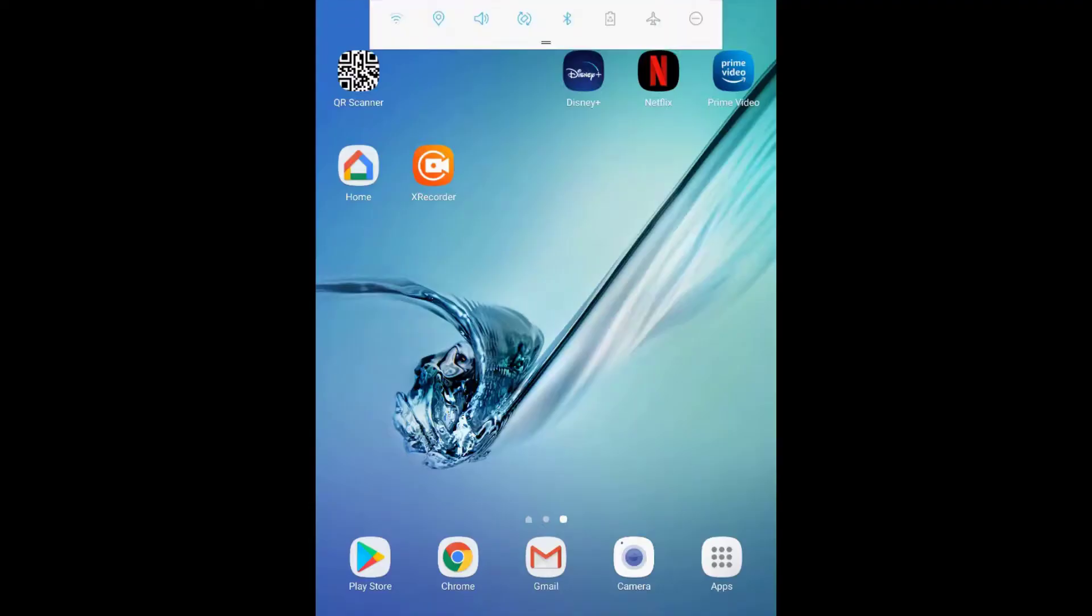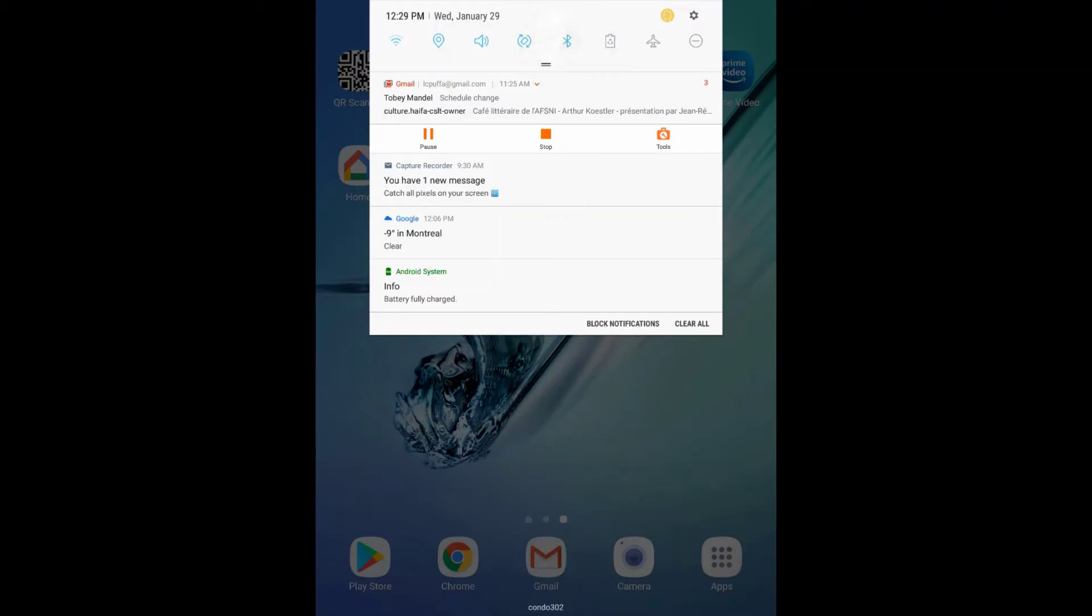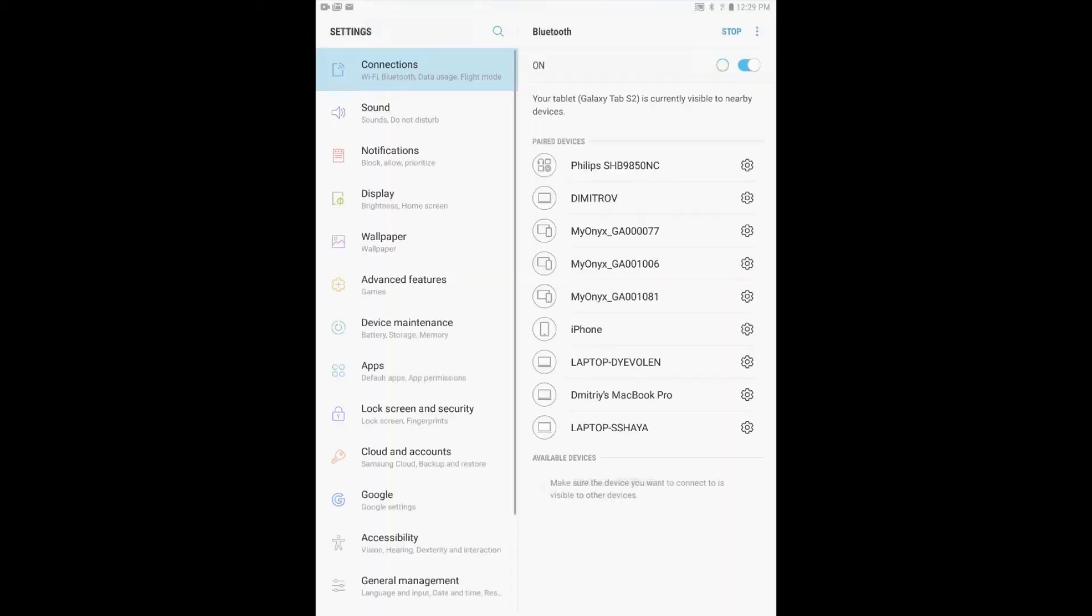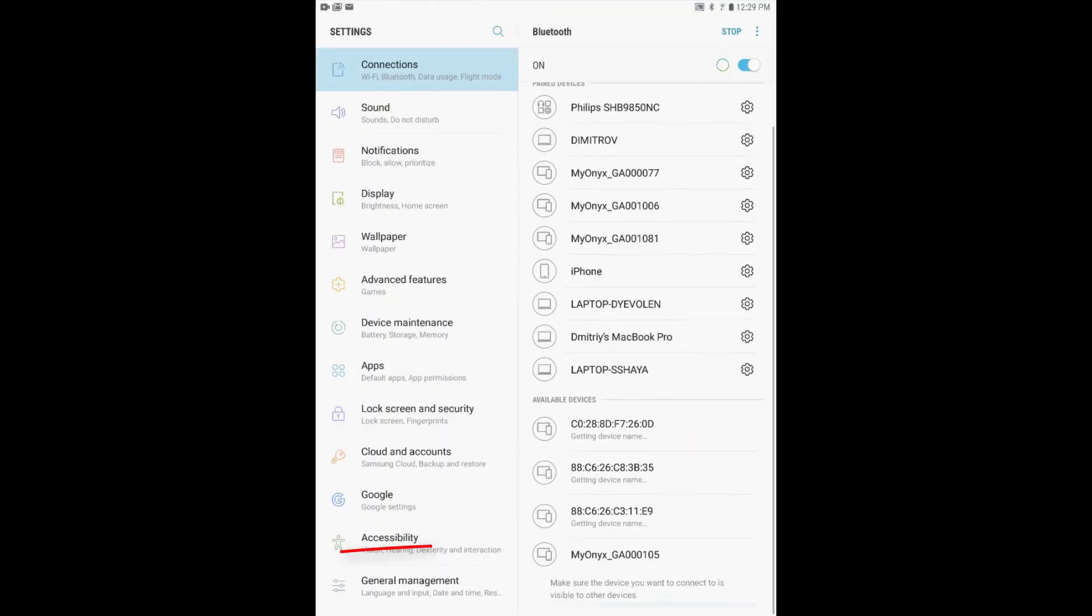On your tablet, access the Bluetooth device menu. This can usually be reached by selecting and holding the Bluetooth icon from the device's settings menu. On the list of available devices, select your device.